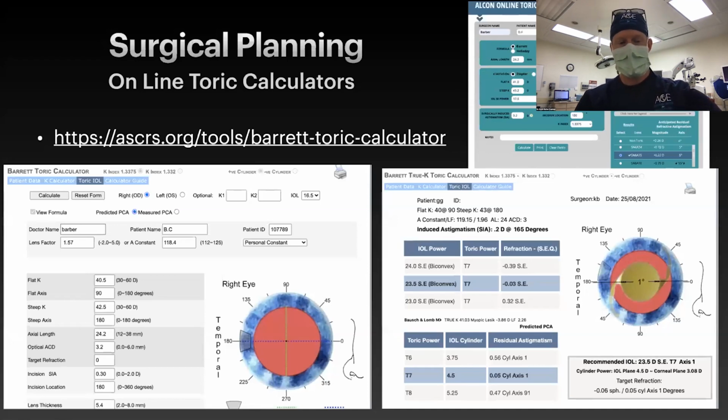So you'll put in your basic information. You can see on the left there, your Ks, the axis of your Ks, your axial length, your ACD. You enter all that information in. It allows you to select which type of toric lens, whether it's an Alcon or a B&L or a J&J or a Star. You can pick which one you want to use, and then it will tell you where to put that lens and how strong of a lens to use, whether it's a T3, 4, 5, or 6. So all of the math is done for you. So it's a very simple process of just entering in key information and some key data into one of these toric calculators.